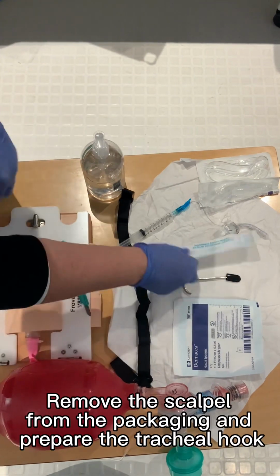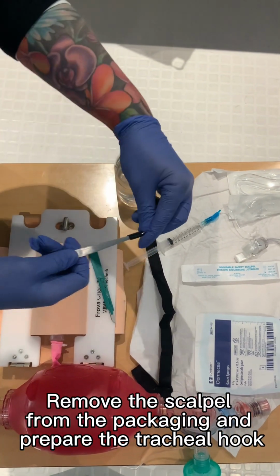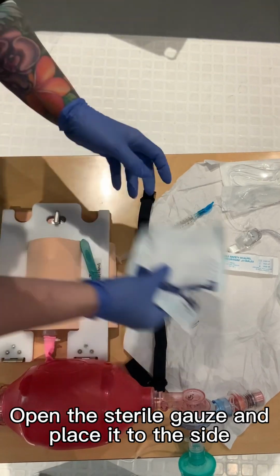Remove the scalpel from the packaging and prepare the tracheal hook. Be careful not to injure yourself. Open the sterile gauze and place it to the side.